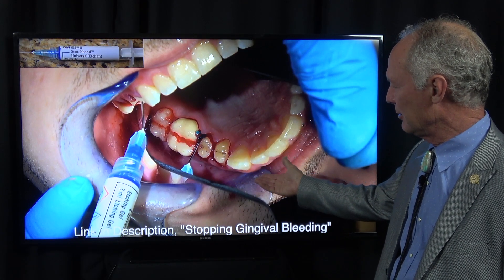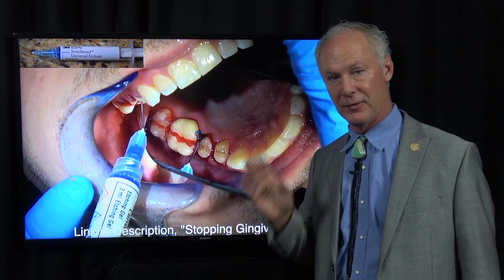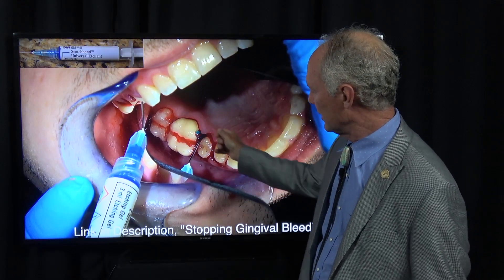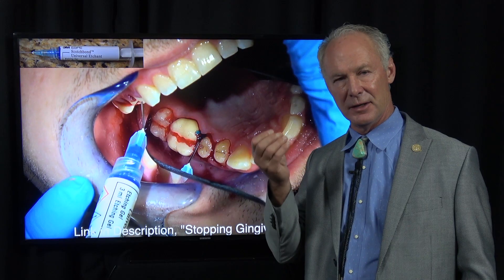They come in and they're not pristine. So what do you do when they're bleeding? This is the best hemostatic agent I've ever found: 38% phosphoric acid, just like you use to etch teeth before you place composites. Squirt that on the bleeding gingiva and leave it for about 45 seconds to a minute. It doesn't damage the gingiva — what it does is cause that bleeding area to scab and stop bleeding.